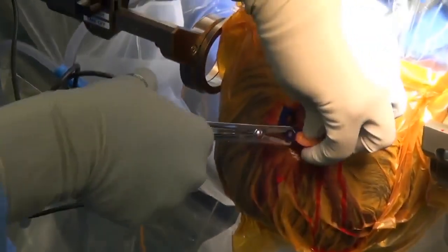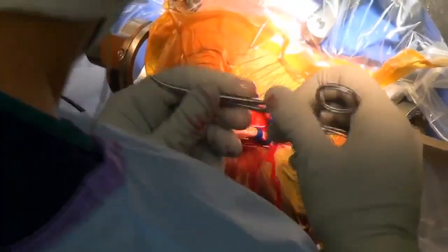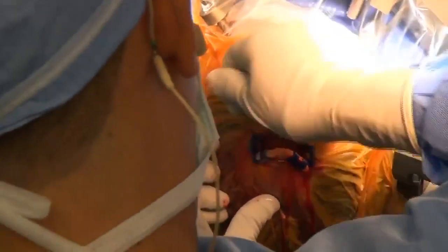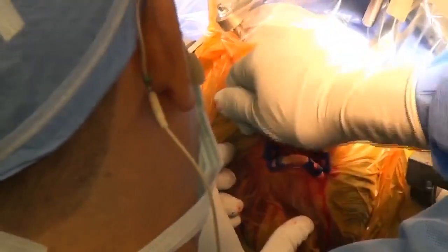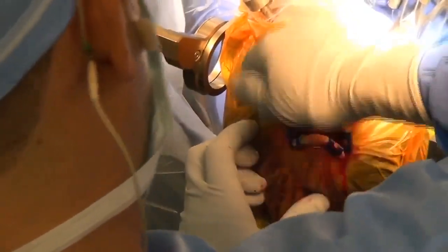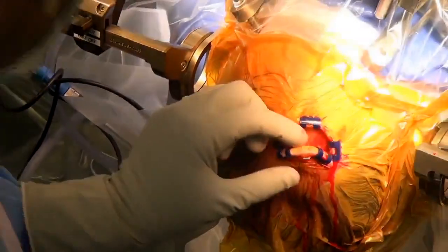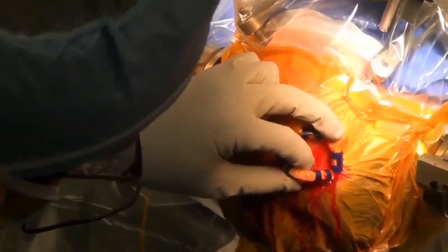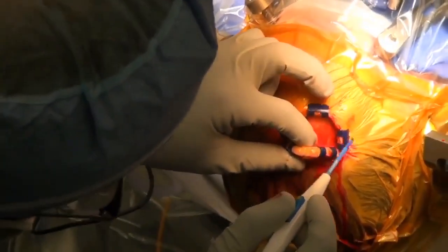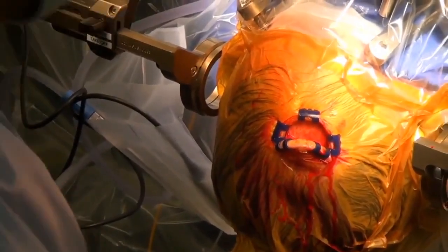Gonna take a snap next. I got Sylvia as my scrub. She knows my every move, so let's go very nice and smooth. Okay, make a little pocket for later. So this is where we're gonna be tucking our wires for the next part of the operation where we bring it down the neck. Let's see the bovie again.